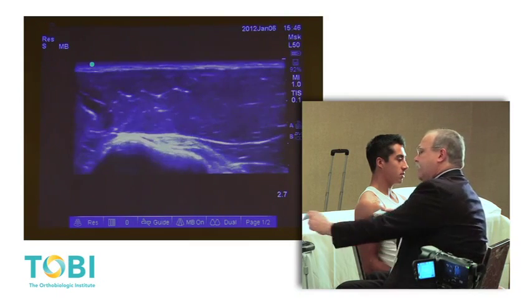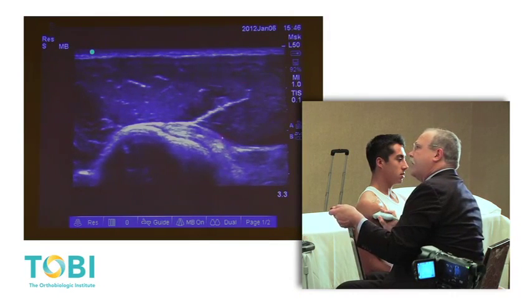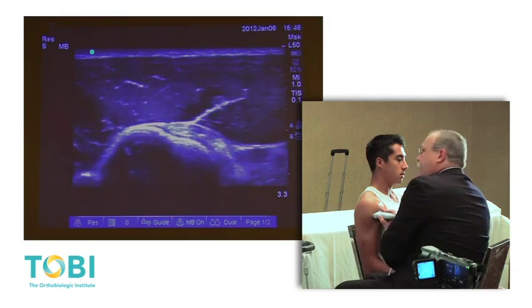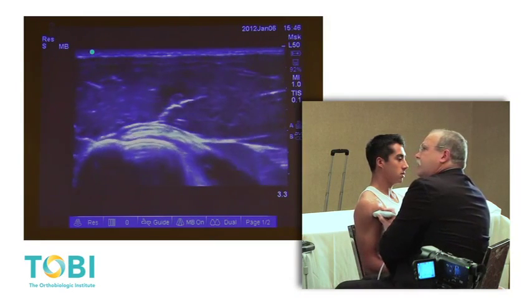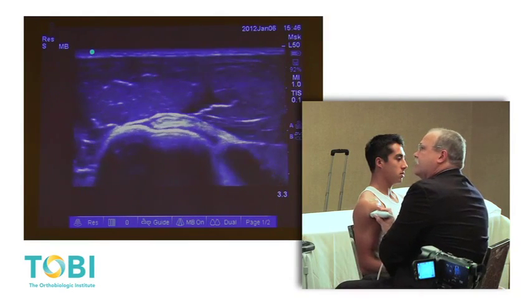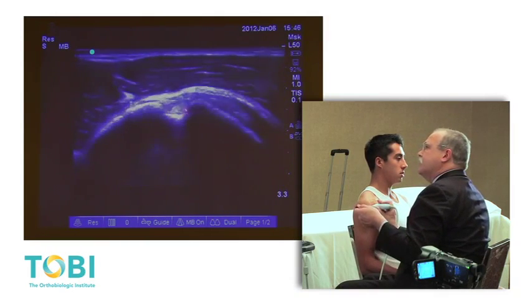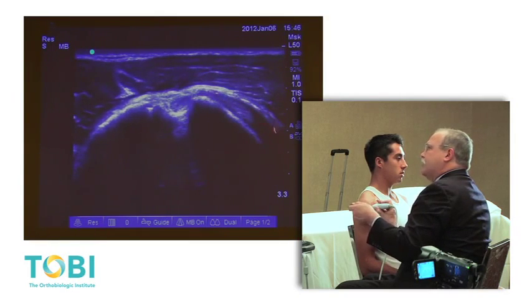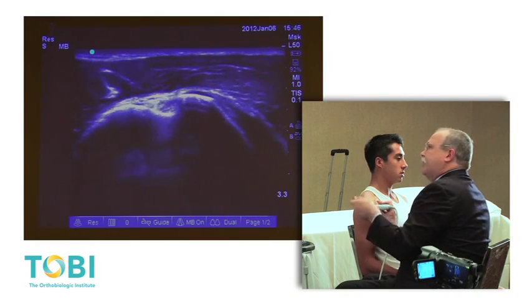Working down distally and changing my depth, one click, we'll work down until we see the pectoralis tendon coming over the top and attaching to the humerus. And if you want to see the pectoralis tendon stretch back and forth across, you can internally and externally rotate the arm. Ultrasound's a very nice way to look at the pectoralis musculotendinous junction. Working back up in short axis, biceps tendon, and now at the top of the groove, you start seeing subscap with some anisotropy where the tendon fibers are coming in this direction, so obviously you lack beam perpendicularity.